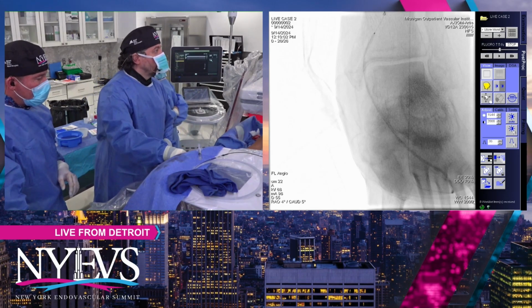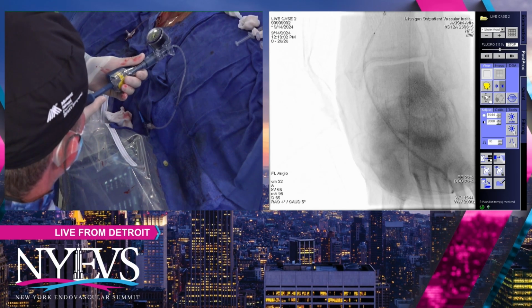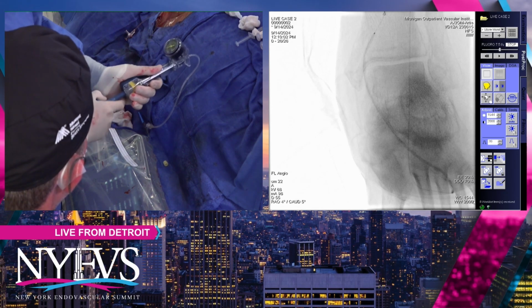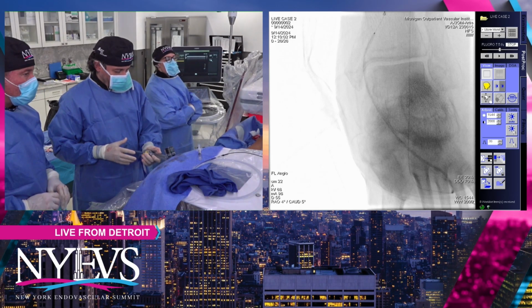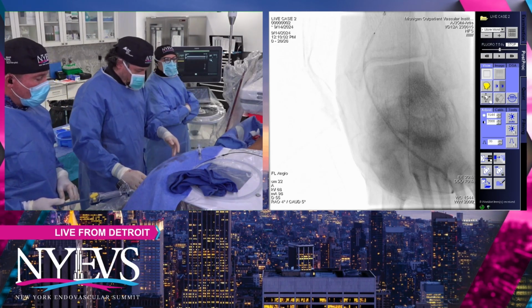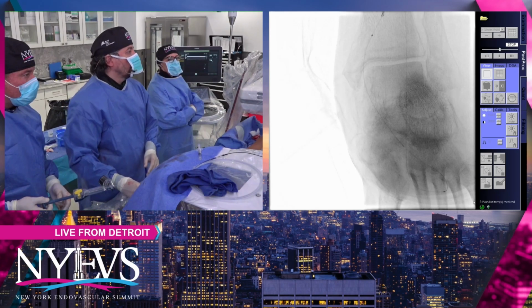Fadi, it's Liz. You've done a great job so far. I think the results you've gotten through the AT are remarkable. Quick question for you. Obviously the point of doing the pedal loop is to get more perfusion to the heel. You have what looks like a flow-limiting lesion in the TP trunk, and you have some good flow. What you started with, if I remember correctly from the initial angio, was that what was feeding the foot was the peroneal. Is there a reason why you chose to come through the pedal loop to get to the heel as opposed to optimizing the flow through the peroneal to see if you can get some more collaterals from the peroneal itself?